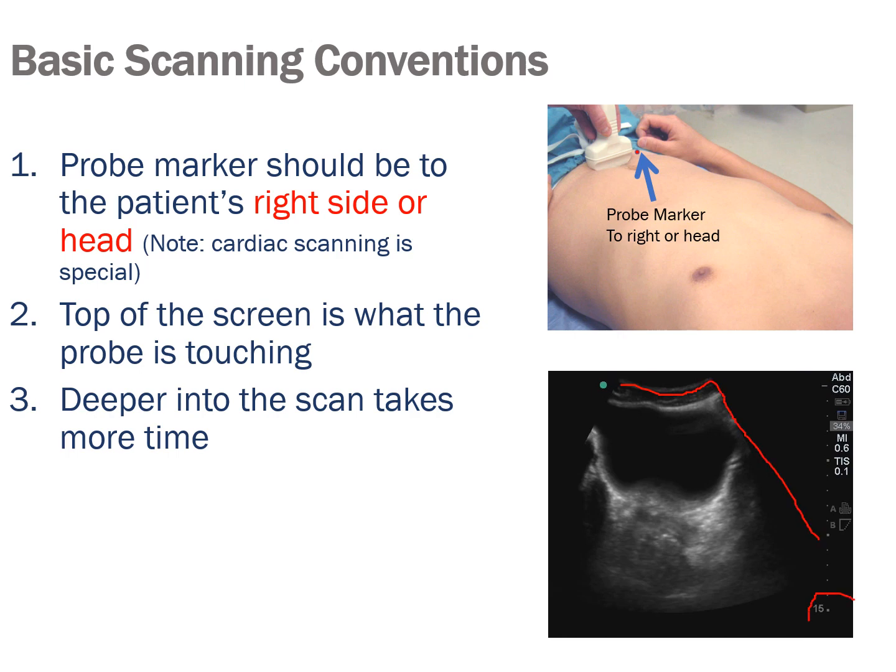We can see the depth is set at 15 centimeters in total, and that would mean that the bladder is about halfway through that, or 7.5 centimeters. We can see an anechoic bladder, and we can actually see an organ in behind this, which, in this case, looks like the uterus.